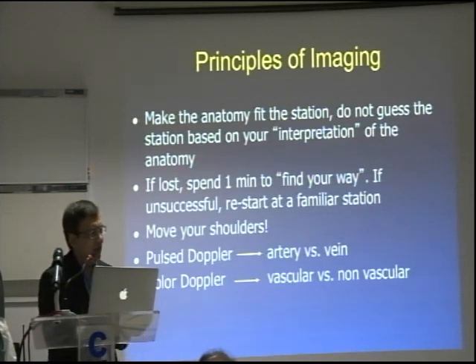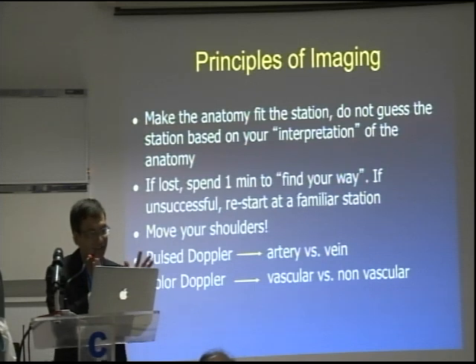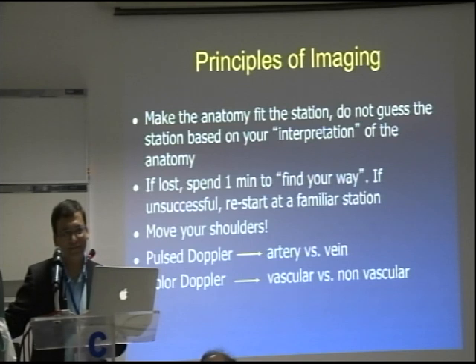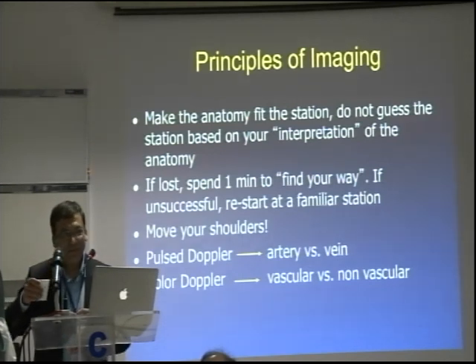You will find the aorta, you will find the liver. When I started, the only structure I could recognize right away was the liver. And all of us are going to get there, but you do get excited: at least I know what that is. Just a point on that. When I was a fellow, my attending said, "Can I look at the liver?" And I looked at it for about 2 minutes. I said, "The best detailed exam of the liver." And he said, "The spleen looks good, now show me the liver." So as a fellow, I couldn't even differentiate between spleen and liver.